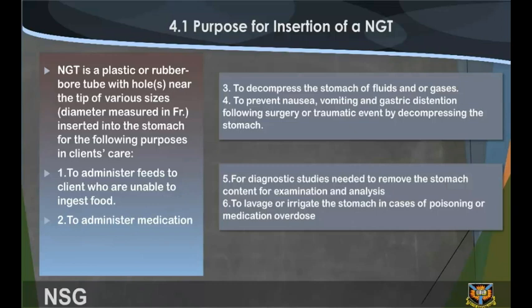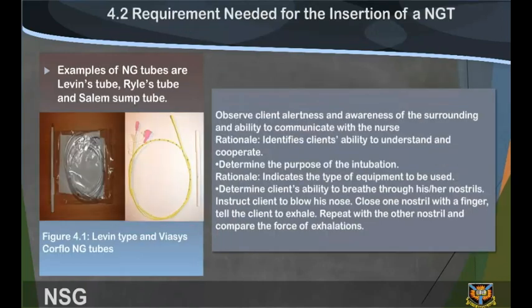4. To prevent nausea, vomiting, and gastric distension following surgery or a traumatic event by decompressing the stomach. 5. For diagnostic studies, to remove the stomach contents for examination and analysis. 6. To lavage or irrigate the stomach in cases of poisoning or medication overdose.